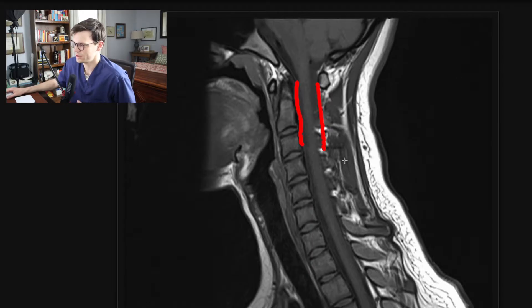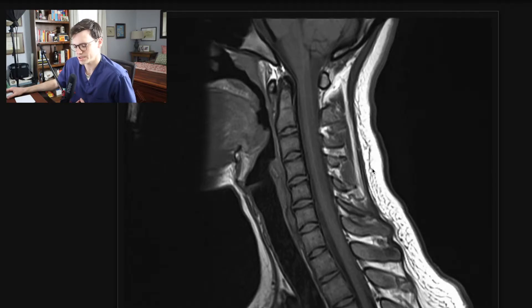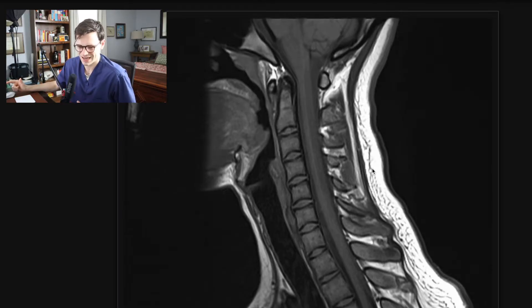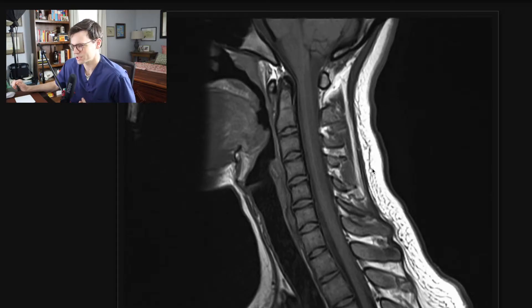Within the canal, you have the cerebrospinal fluid in the subarachnoid space, and within the canal you have the actual cord — the gray structure continuing inferiorly from the brainstem. We see all of the cervical cord as well as a little bit of the thoracic cord as well. Things you can find in the canal that you definitely want to catch are hemorrhage, phlegmon — which is infectious enhancing soft tissue — and one step further beyond phlegmon is abscess. The pre-contrast T1 is a good place to start, but you also want to look at your T2s and post-contrast images.